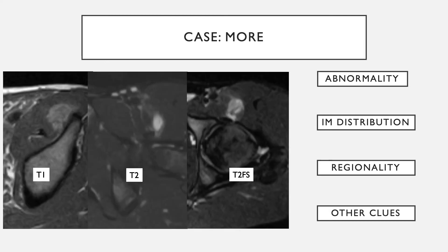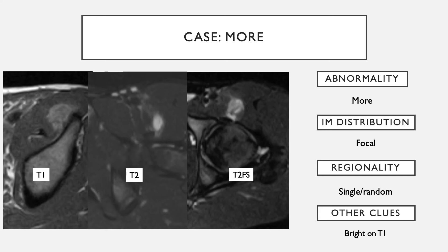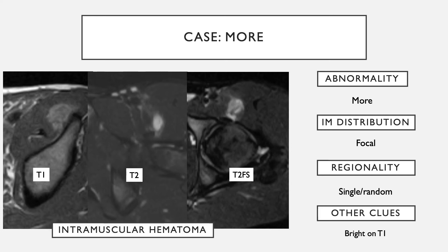Moving to cases with other signal changes: in this case, there is high signal on T1, T2, and T2 fat suppressed images. The intramuscular distribution is focal, not involving the diffuse muscle, and in a random location within the muscle. The T1 brightness makes one think of something proteinaceous, possibly hemorrhage. This is an example of an intramuscular hematoma — which could be associated with a tumor — and one might give intravenous contrast or follow it up. In this case, the patient had a known history of trauma and the finding resolved.